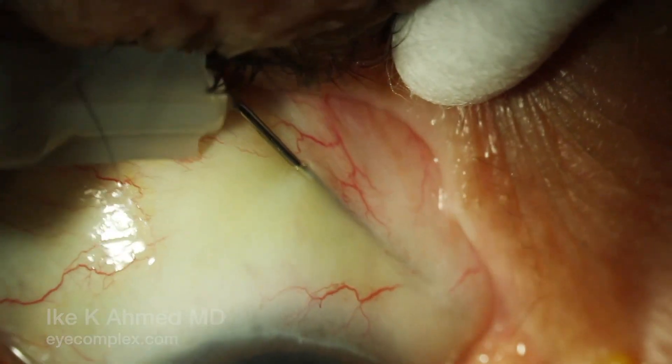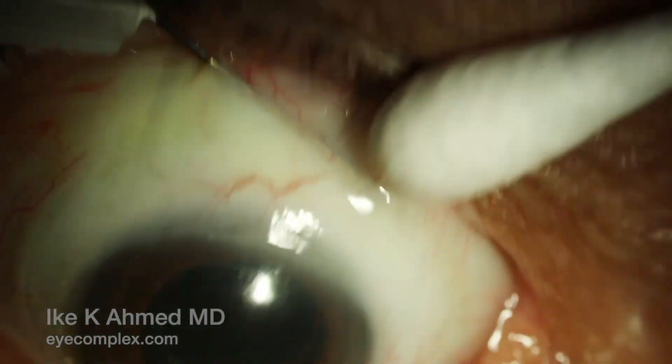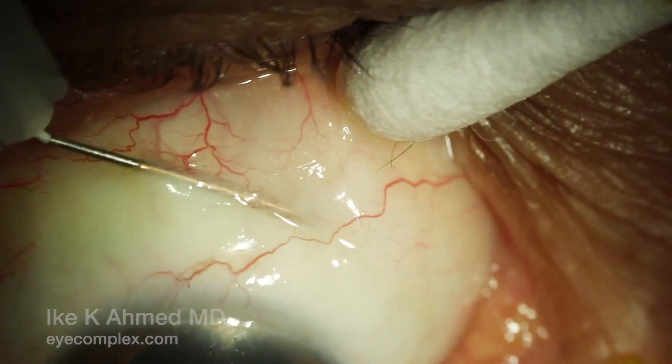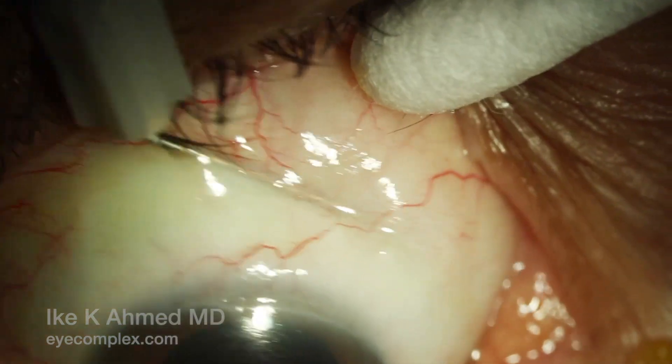What we first visualize here is the Zen implant. You can see it under the conjunctiva. The needle bevel is placed under the implant carefully and slid under the implant, and then the needle is swept toward the fornix.